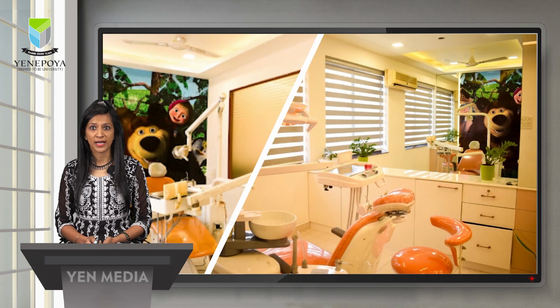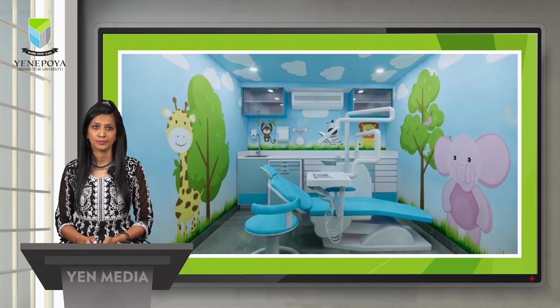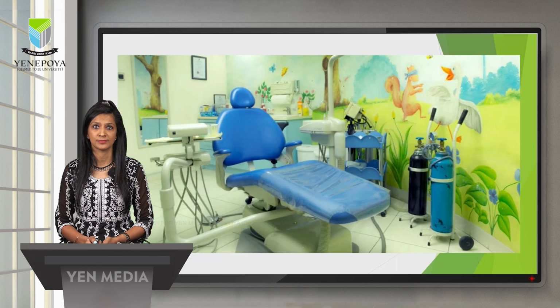This is an image of a private clinic setup. As you can appreciate, there is a mural on the wall. It is bright. This clinic gives positive vibes. There is no negative stimuli anywhere which will distract the child. And there are bright colors which are incorporated in the dental chair. This is another image which would definitely be approved by the child. Another dental setup exclusively for children where you can appreciate the bright colored murals on the wall.